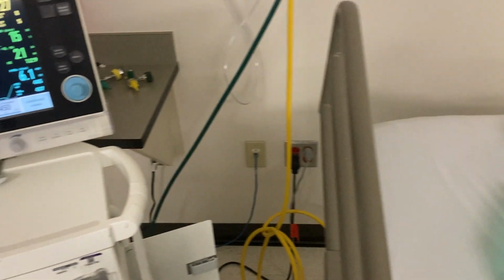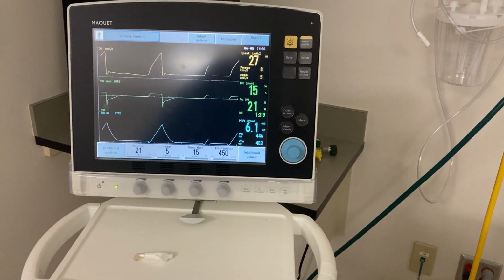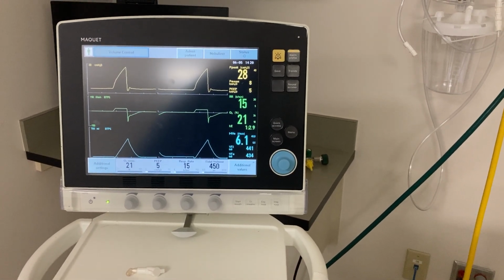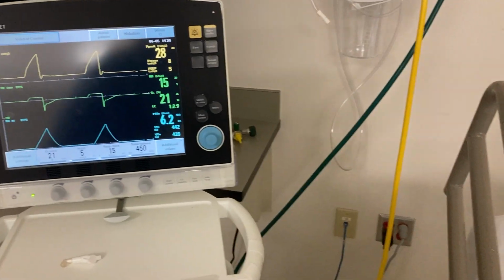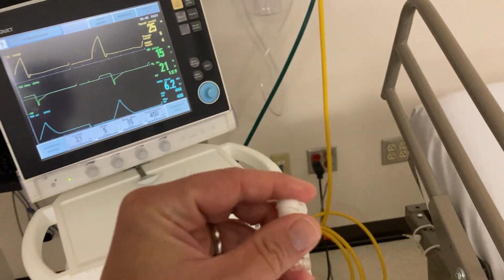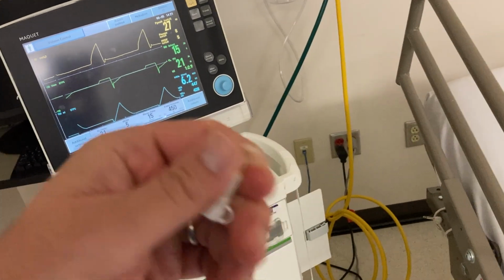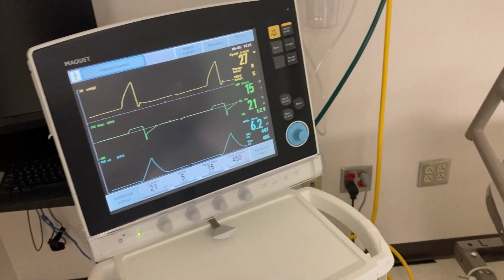So for instance, if I plug that port there and I'll show back at those ventilator graphics, we can see that we no longer have a leak. We can also see that expiratory tidal volume increased just a little bit from where we were at as well. So what happened here, there's a port that's supposed to go on, and that's the port that you can instill saline. This port has inadvertently, whether through turning a patient or what have you, gotten pulled off of the ventilator circuit. So we've got to make sure that we pay attention to what's going on.